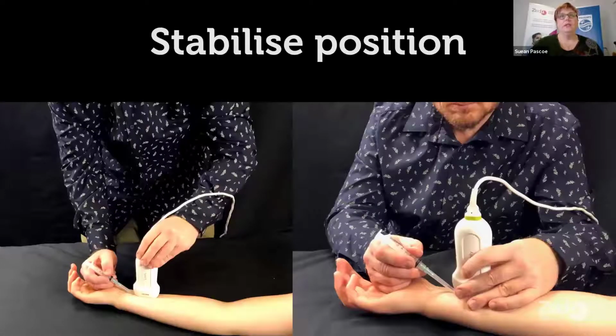The other thing to think about when you're setting yourself up: we have an example here standing up where you're looking down on it. If you're looking down, chances are you're going to put pressure on the vessel because you're leaning a little bit, versus being able to sit down and stabilize your forearms as well. If you stabilize your forearm position, it means you can have a much lighter touch with the probe, and everything is much more steady. There's less slip, and the probe position is held in a real steady position. So make sure you either bring the bed up or get a chair, whatever it needs to be, and try to stabilize your hand position because that will help you get better access.